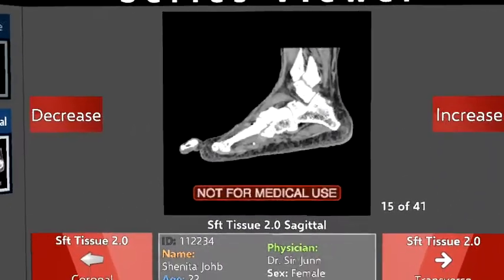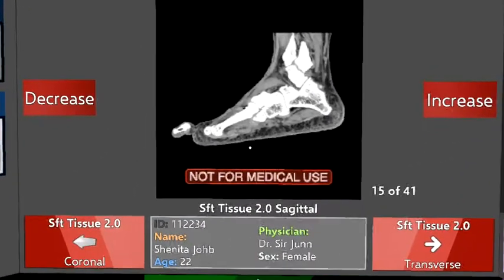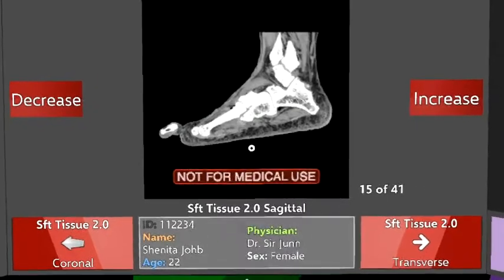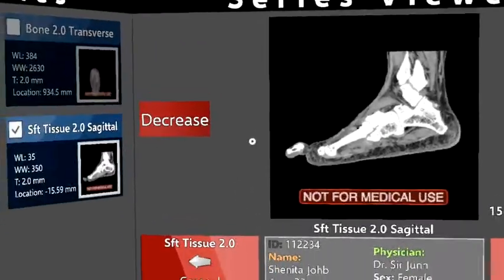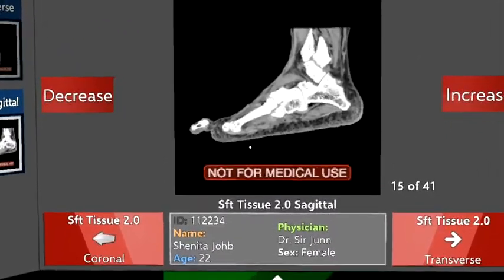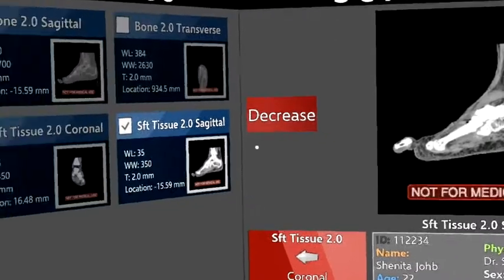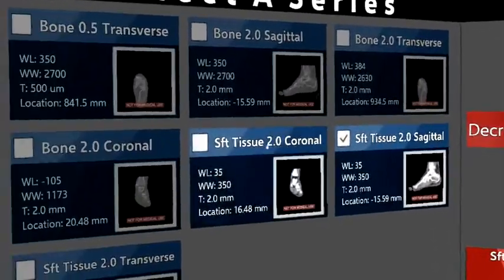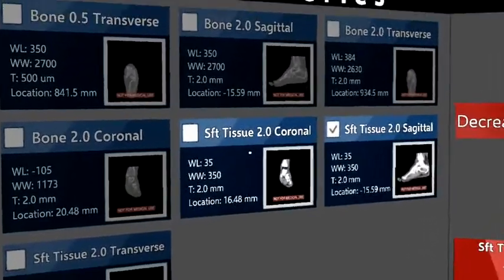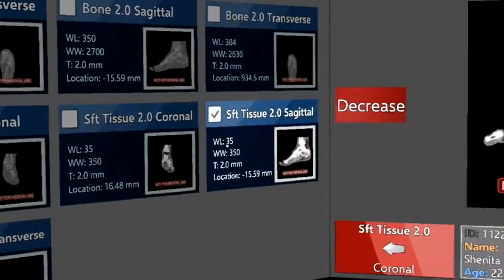In the series viewer we have the ability to scan through the series and look at different images within the series. And we also have the ability to choose different series within a scan.